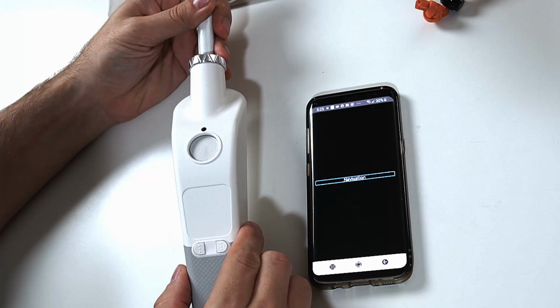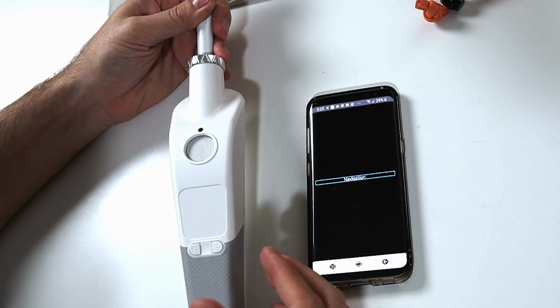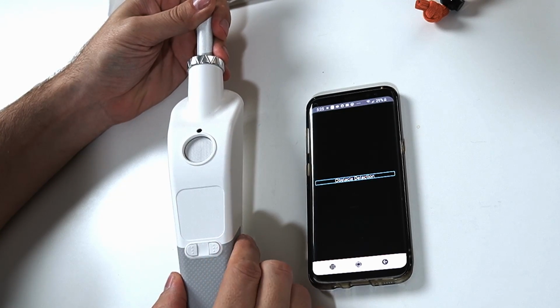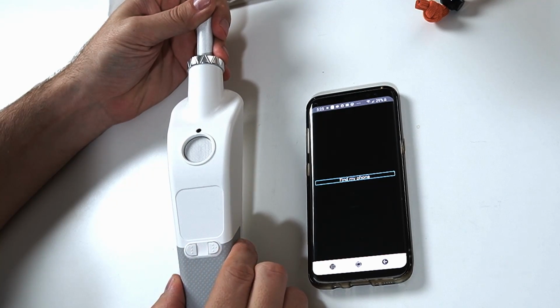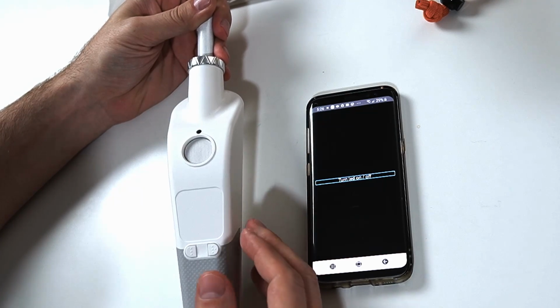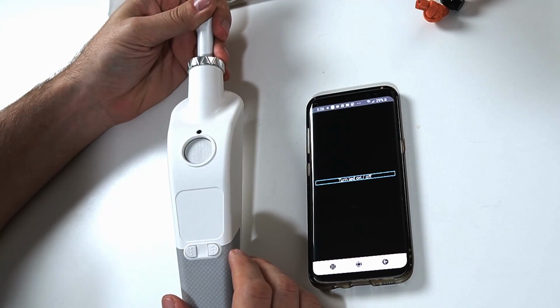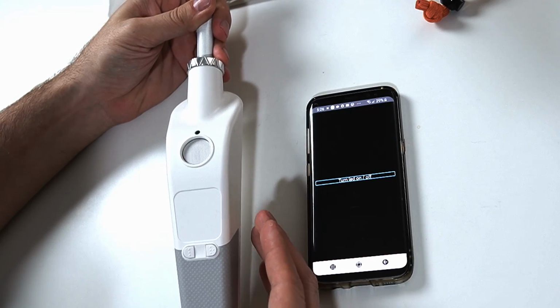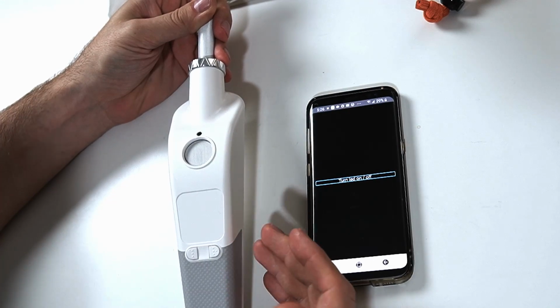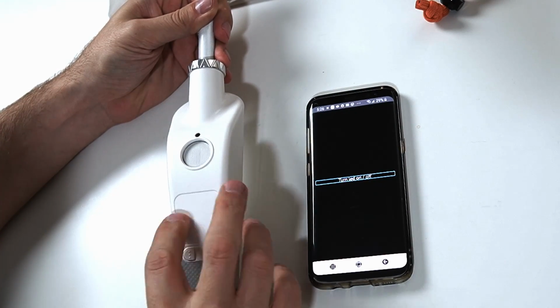Navigation. No saved location has been found. And if I swipe to the right or left, I can cycle through the menu here. Nearby stops. Obstacle detection. Find my phone. Turn LED on. It's a little hard to understand, but she said turn LED on. So you can turn that little LED on so that if you're walking around at night, it gives a little bit of visual indicator so that people around you can see you coming a little bit easier.